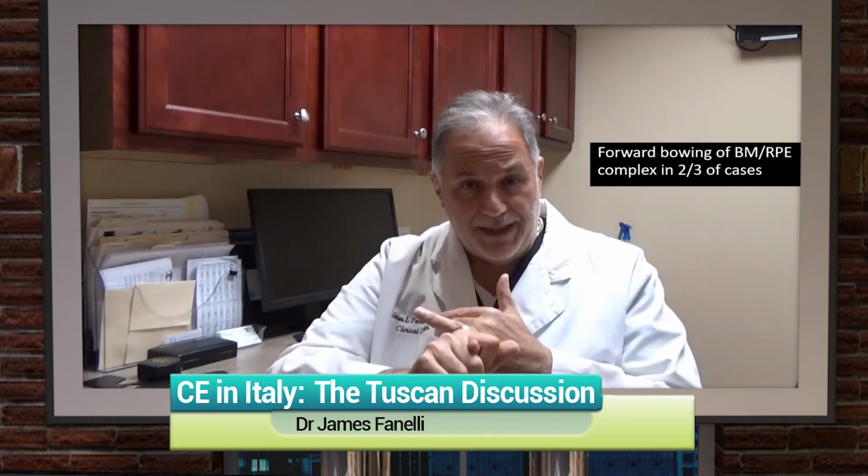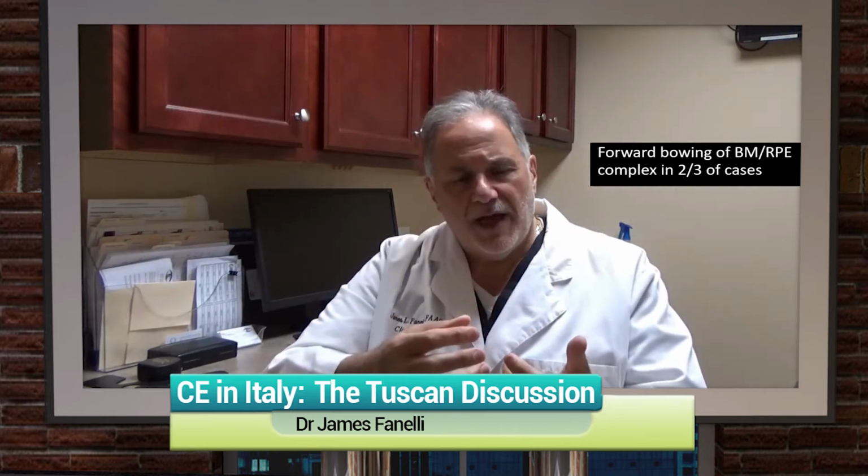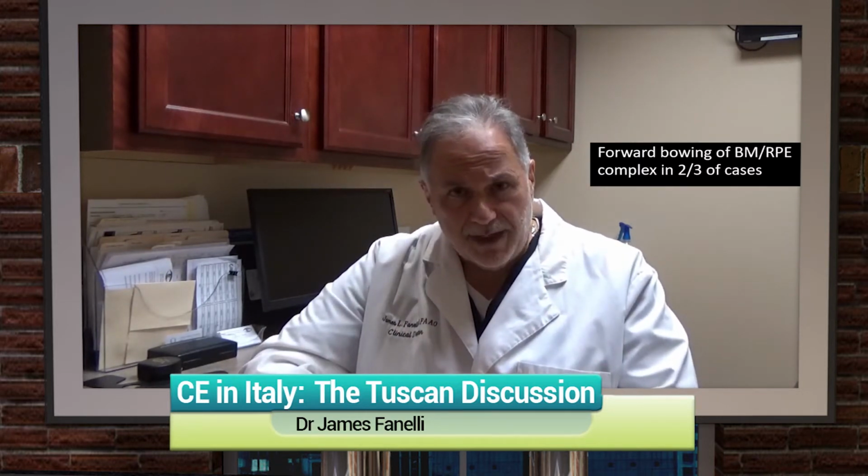on OCT. Invariably, and there are exceptions to every rule, but invariably in papilledema, we're going to preserve some of the optic cup. Now, as papilledema progresses through the several Frisén stages, especially when it gets very, very significant, we can lose certainly the optic cup.